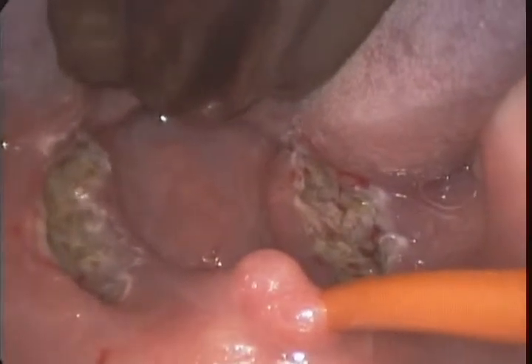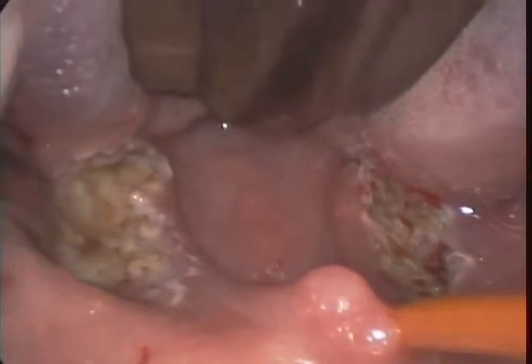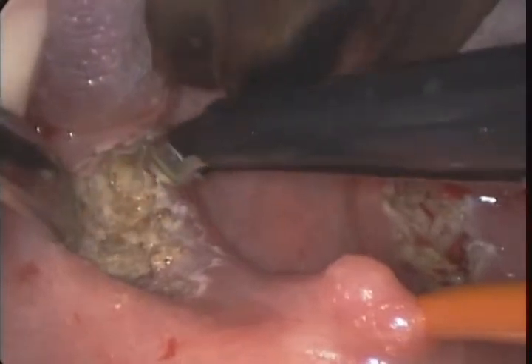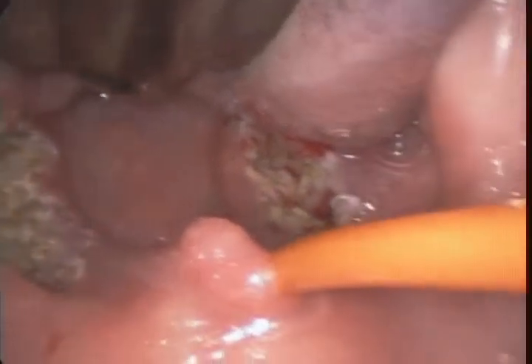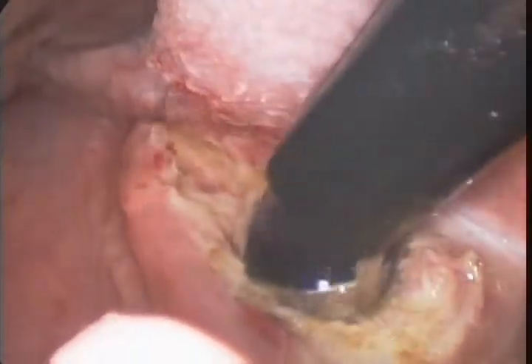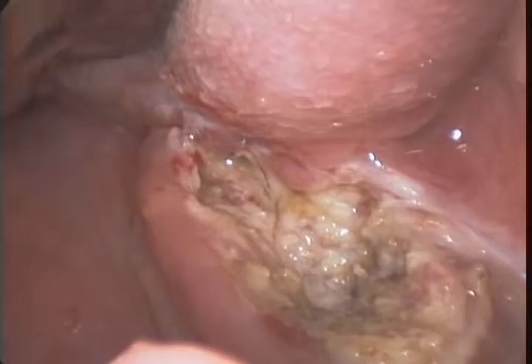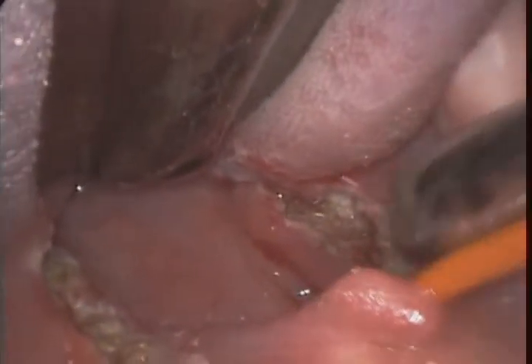So this is the completed intracapsular tonsillectomy. I'm going to retract this pillar and you can see the concavity of the tonsillar fossa. The capsule has not been violated. And then we're going to look on this side, and again, here's the concavity of the tonsillar fossa. This tonsil bed here looks nice and clean, nothing to do. Now we're going to inspect the other tonsil bed, and that's nice and clean.